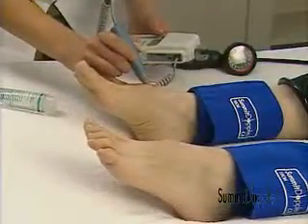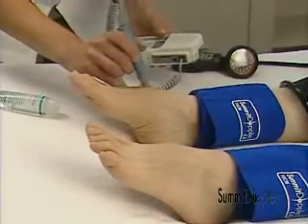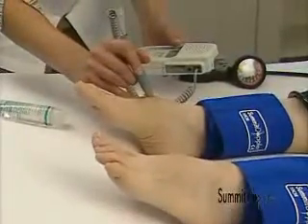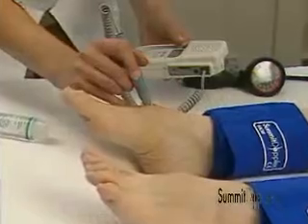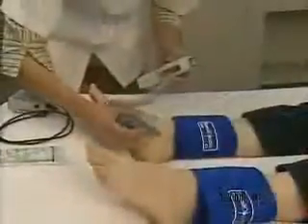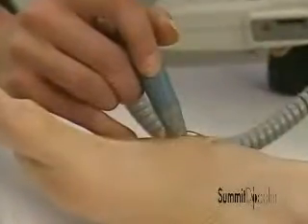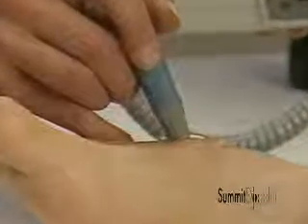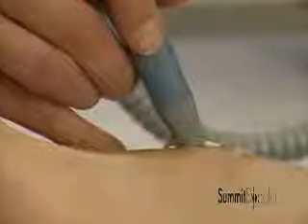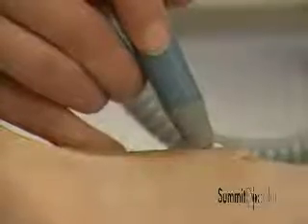As an alternative to the posterior tibial artery, ankle measurements can also be performed at the dorsalis pedis, or DP. The DP is found here. Maintaining the proper 45-degree probe angle can be more difficult at the DP. Although many of our customers prefer to use the posterior tibial artery, sometimes the DP will provide a stronger Doppler signal. And pressures from both arteries should be obtained if the patient is suspected of having a tibial arterial occlusion, thromboembolus, or has undergone a tibial bypass.